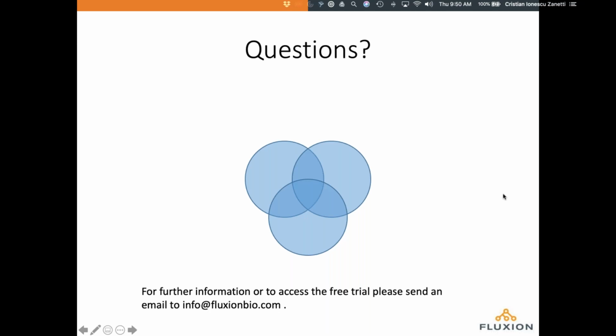What's the sequencing depth required to detect 0.1% variance, and how does that compare with duplex UMIs? That's a good question. Right now, our sequencing requirements in terms of depth are 5,000x per molecular amplification pool or per technical replicate. So the total sequencing depth requirement to detect 0.1% is 10,000x per sample. I think that's significantly less than the depth required for duplex UMIs, which I believe is over 30,000x, but I'm not 100% sure.